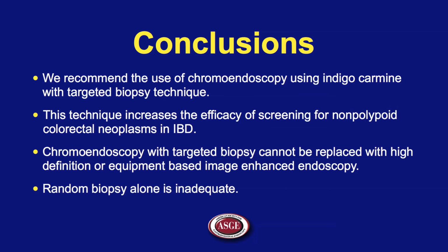In conclusion, random biopsy to detect dysplasia in inflammatory bowel disease is inadequate. The use of indigo carmine with targeted biopsies of suspected neoplasms increases the efficacy of screening in IBD. This technique cannot be replaced with high-definition or equipment-based image-enhanced endoscopy.